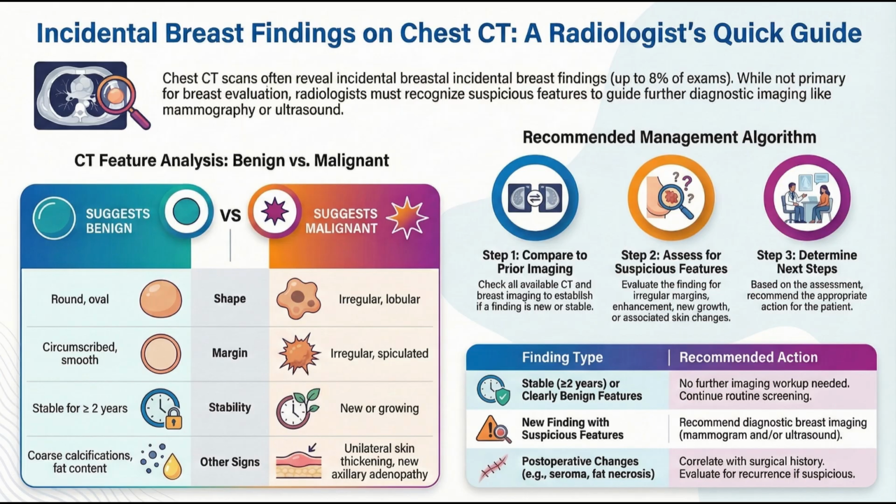So if a radiologist spots a little area of concern, how do they describe its location so a specialist can find it later with, say, an ultrasound? It's all about clock face localization, just like in standard breast imaging. So they'd say something like upper outer quadrant at 10 o'clock. Exactly. 10 o'clock, and then they'll give a radial distance from the nipple. But this is where it gets tricky, isn't it?